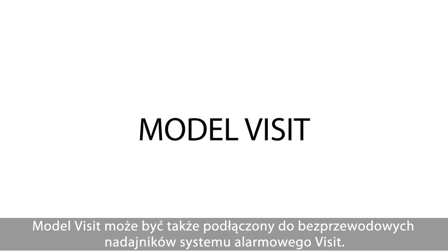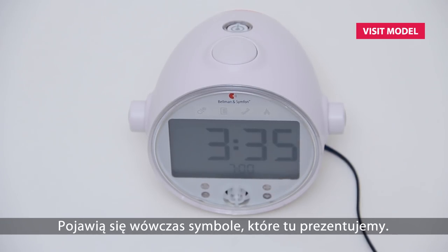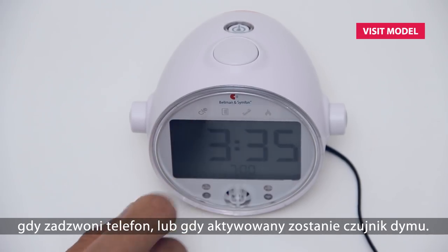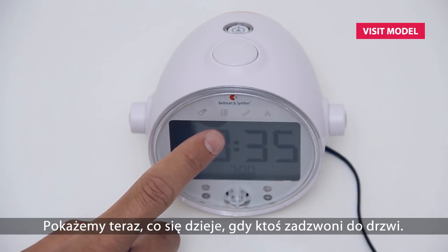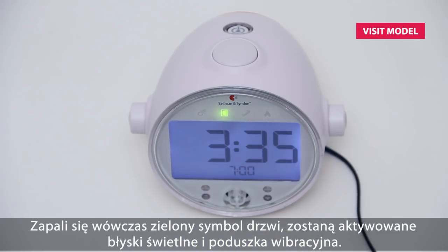The Visit model can also be connected to the wireless transmitters of the Bellman Visit alerting system, indicated by the symbols shown on the clock face. It will alert you when your baby is crying, when someone is at your door, when the telephone rings, or even if the smoke detector is activated. The Bellman Visit transmitters are purchased separately. In this example, I will show you what happens if someone rings your doorbell — the green door symbol will light up, the flash and bed shaker will be activated, and you will hear a door chime.